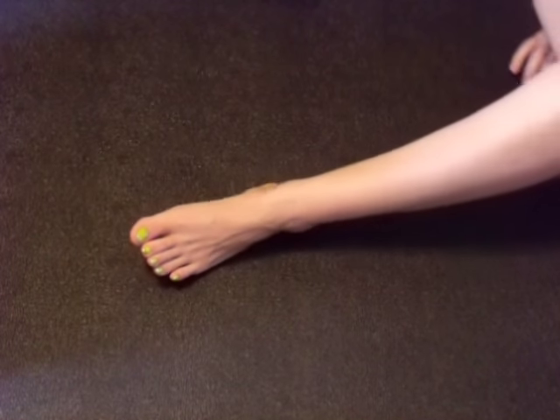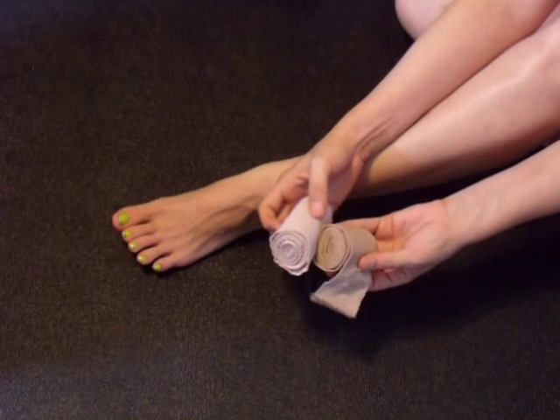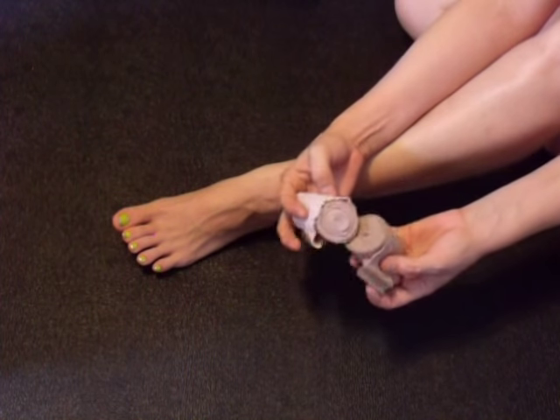Hi guys, Make It All Maniac here today to show you how to make an ankle brace using just ace bandage. That's right, just ace bandage.